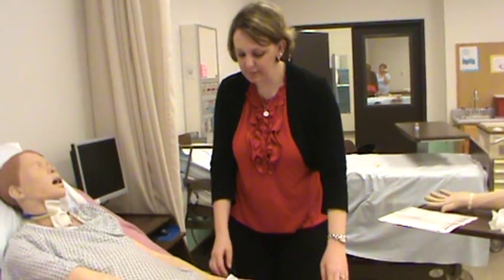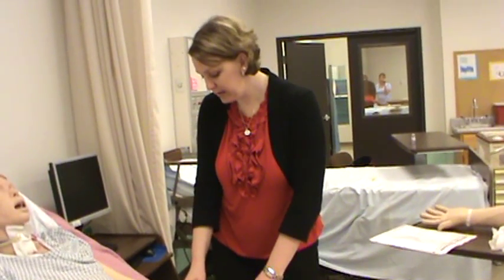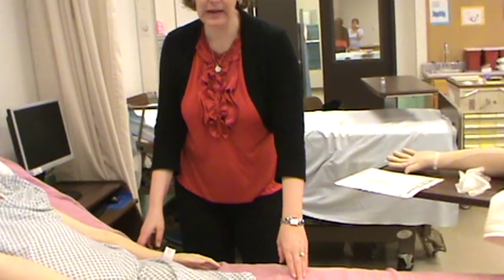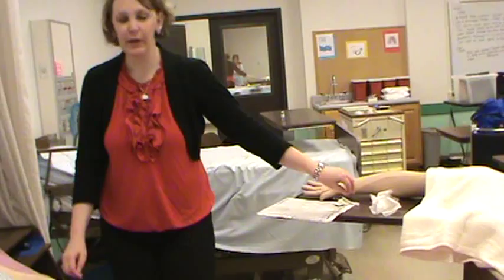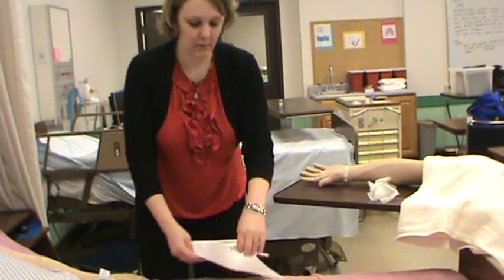The doctor has ordered a TB test for you before you go to the nursing home. Can you verify your name and your date of birth, please? Okay, that looks great. Notice I'm keeping my medication where I can see it. I'm not keeping it over here where my back is to it. I'm going to keep it where I can see it at all times.